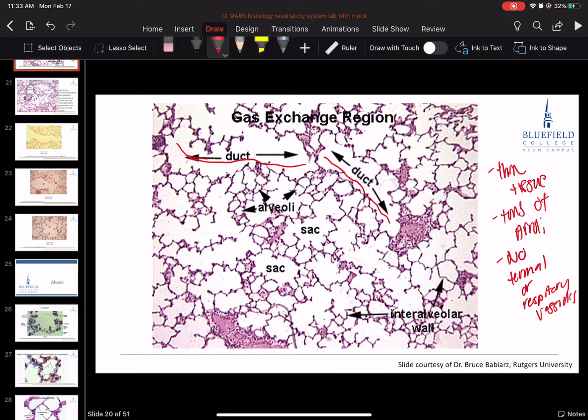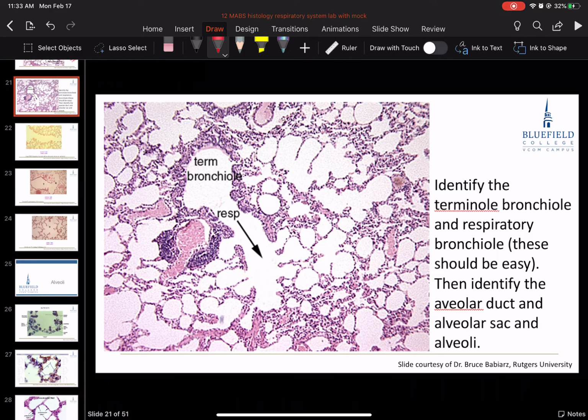Okay, here on the other hand, if I take a look here, I've got an air passageway and it's got thick lining all the way around it. When I start coming here, here's an alveolus coming off and then some thick, alveolus coming off, look, thick, alveolus, a tiny bit of thick, alveolus. I'd put, let's say right where the head of that pointer is, put the star right there, I'm in a respiratory bronchiole. I don't quite get it down far enough yet to get into an alveolar duct.